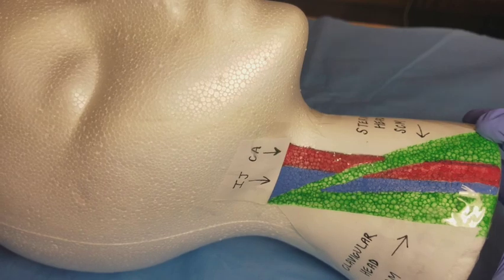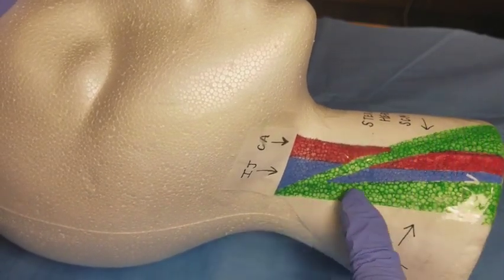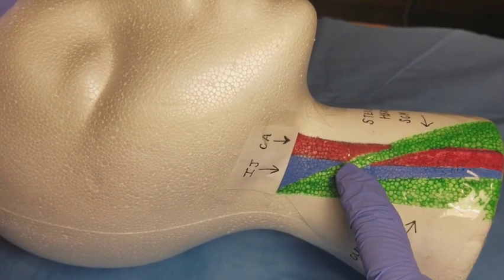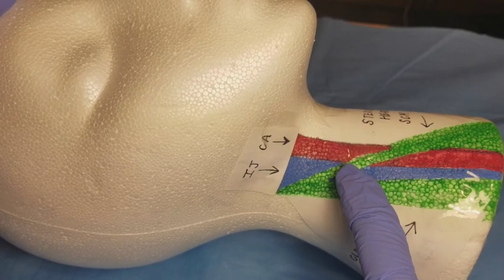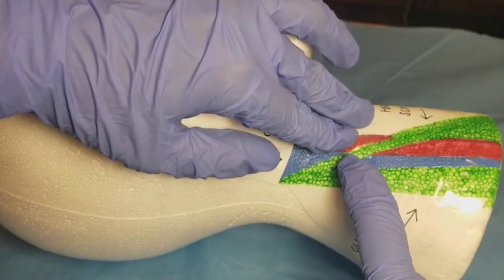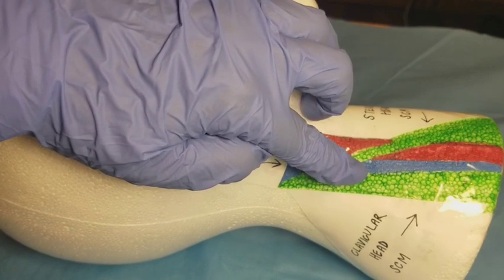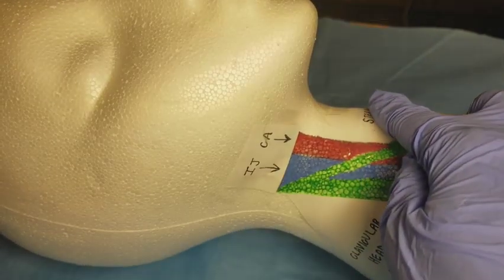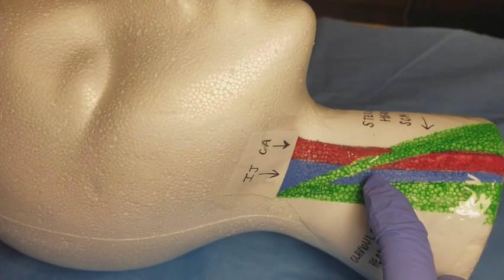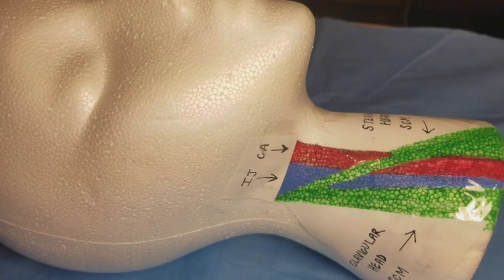although it would be less precise to do it this way, you could feel for the two heads of the sternocleidomastoid muscle, and again, at the apex of those two heads, you would insert there. It may be helpful to feel for the common carotid and then go lateral to that. And this is at the level of the thyroid cartilage. So you want to move lateral to the thyroid cartilage, lateral to the artery, right there. And that's where you hit the IJ.